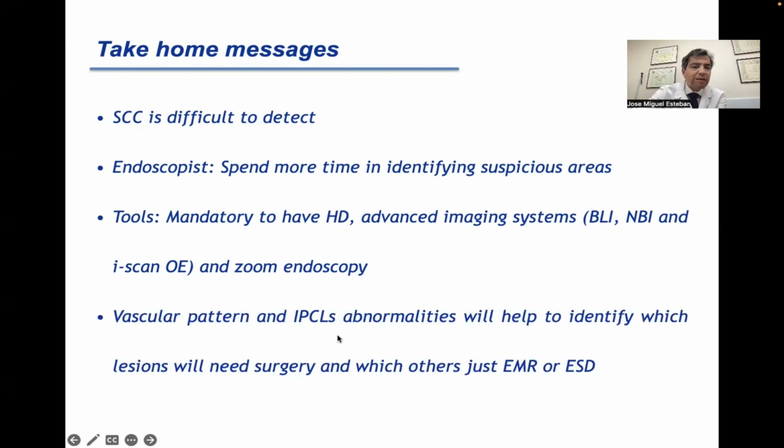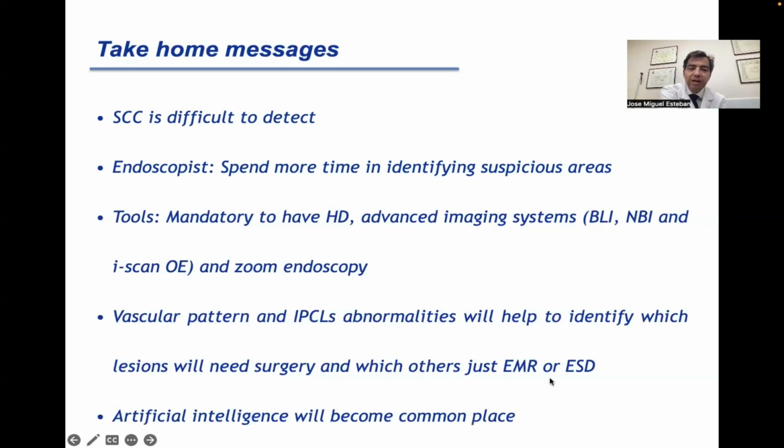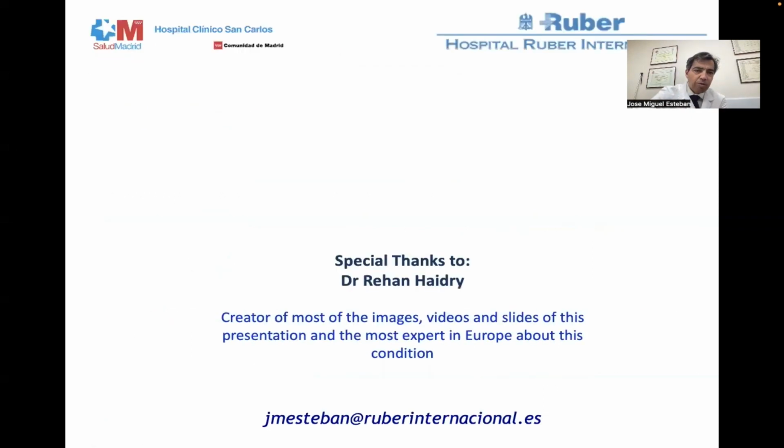The vascular pattern and IPCL abnormality will help to identify which lesions will need surgery and which others just EMR or ESD. And artificial intelligence will become commonplace.